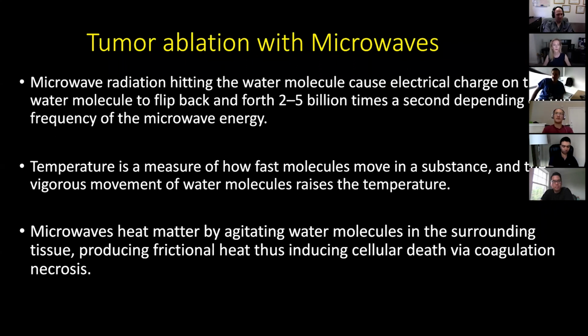The main reason is that if you're using radiofrequency ablation for osteoblastic metastasis, that's not a good choice because the bone impedance stops the machine, and you have to restart the machine, and sometimes you just have to give it up. I don't have that issue with microwave ablation. With the other modalities, I had to look at a CT or an MR to see whether this was osteoblastic or osteolytic metastasis, then pick my modality of treatment. With microwave ablation, I have the luxury of going in both blastic as well as lytic metastasis.